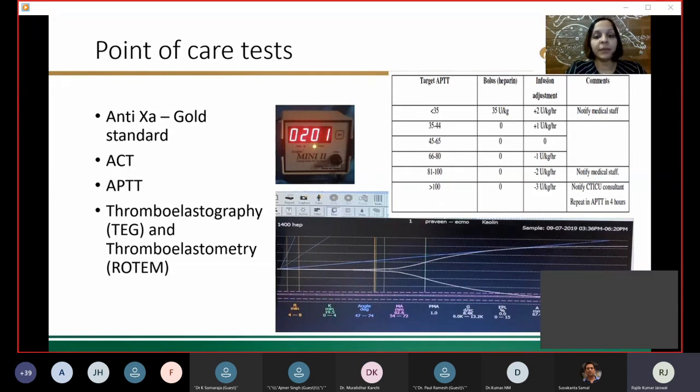In India, most labs run APTT, and most centers use APTT to titrate heparin primarily or in adjunct with ACT in adult patients. Infants have baseline prolonged APTT values, and as a result, it has been thought that APTT would be less reliable. However, point of care devices are available now, and a recent study in pediatric ECLS showed that APTT correlated well with the dose of heparin, better than ACT, and the dose correlation improved with increasing age.